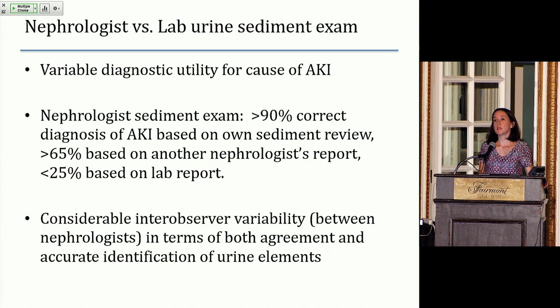So one of the things that always comes up is that the urine sediment exam that we do versus what you see from the lab are different, and certainly skills and training between different nephrologists and experience is an important factor. But there actually are good reasons why when you look at the urine, you see something different to what the lab sees.